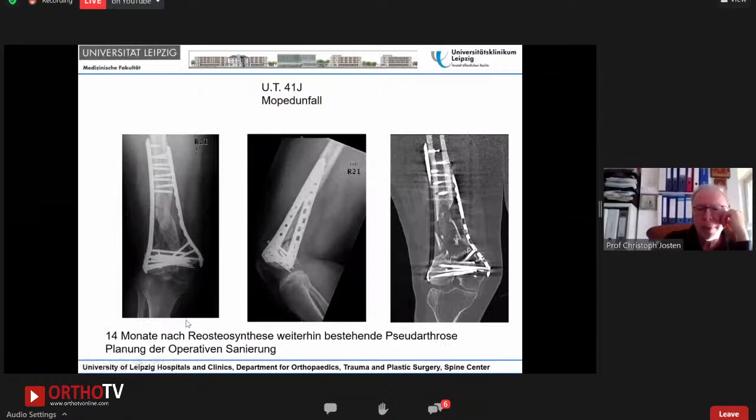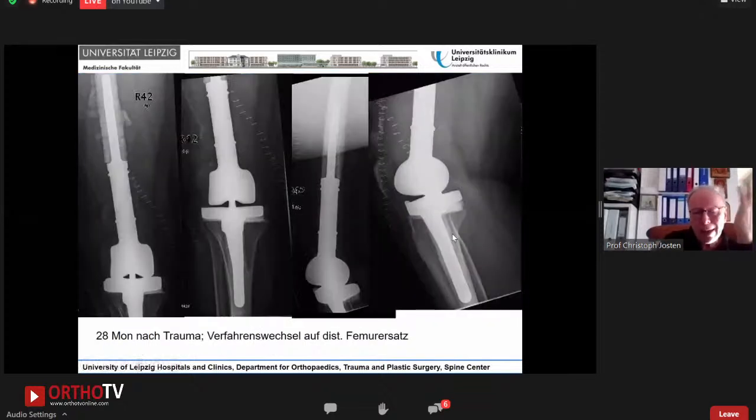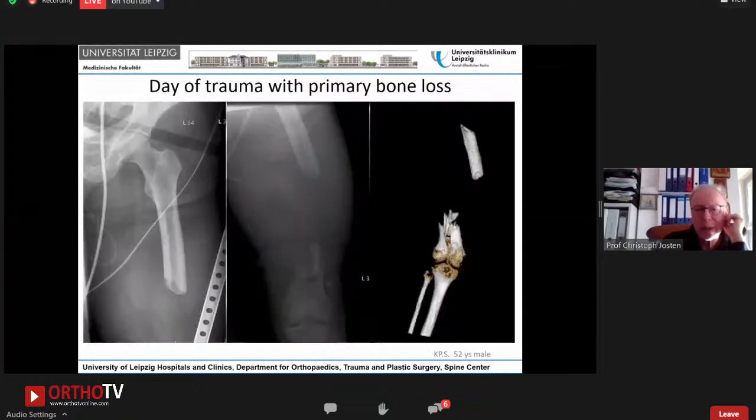We're going ahead. And you see the CT scan with a lot of sclerotic bones. And I decided after a little bit more than two years to make an arthroplasty in this case. So my last case is also an indication where I see the need of a double plating.